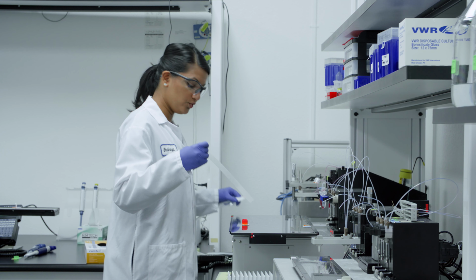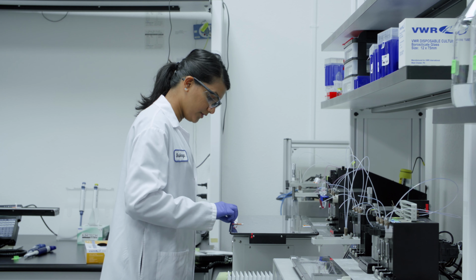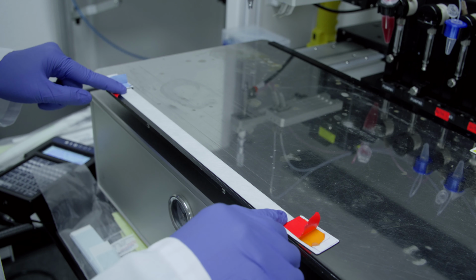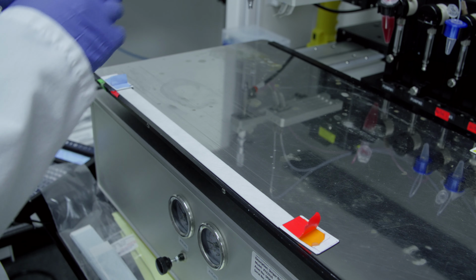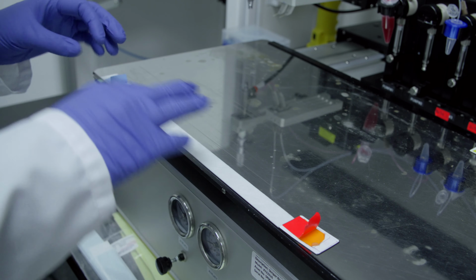And then later, we will take all of these and we will put them together to form our lateral flow strip. All right, so now we are going to dispense our detection label. And the detection label, we aren't going to stripe like we did for the capture. We are going to spray it so it's a little bit more spread out.